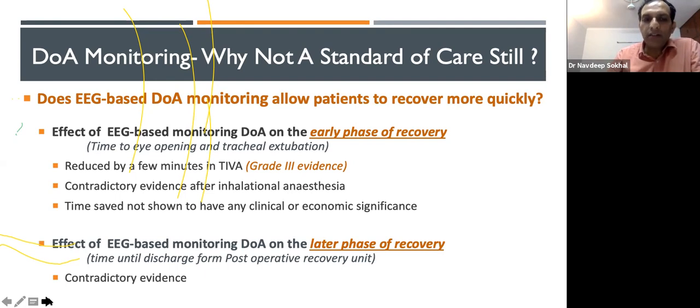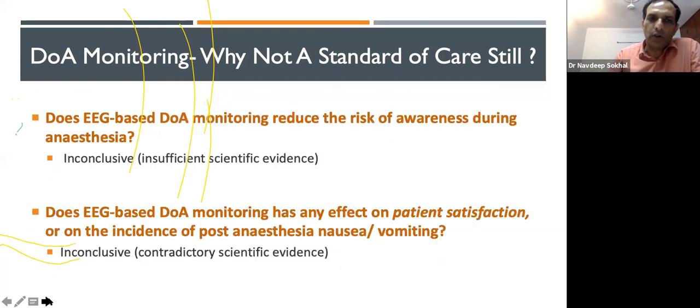Secondly, for the late phase of recovery, that is, from the discharge of the post-operative recovery unit, there is contradictory evidence from various studies. Some say it is slightly better, some say it has not shown an improvement. So there is no clear evidence as of now.